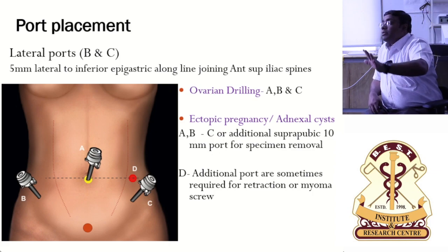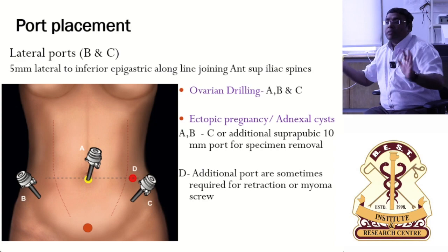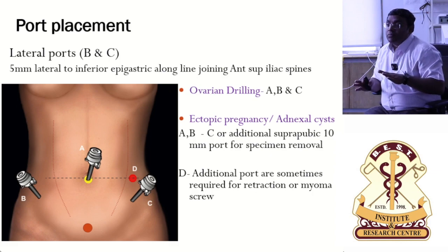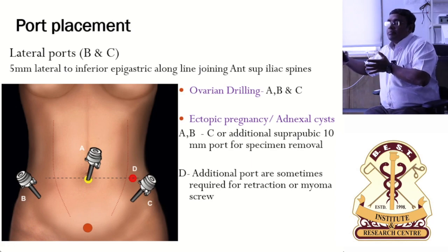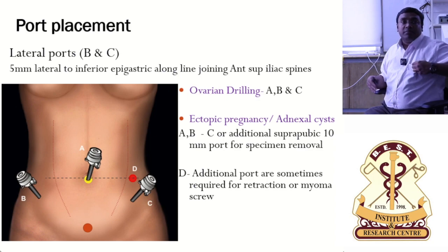So we are trying to simplify things. This surgery I will put like this, that surgery I will not, because the organ of surgery is almost the same, in terms of gynec procedures I am talking about. Only thing is, because the size of the uterus is big, your ports are slightly high up, so that all your energy sources will come without touching the organ of surgery.